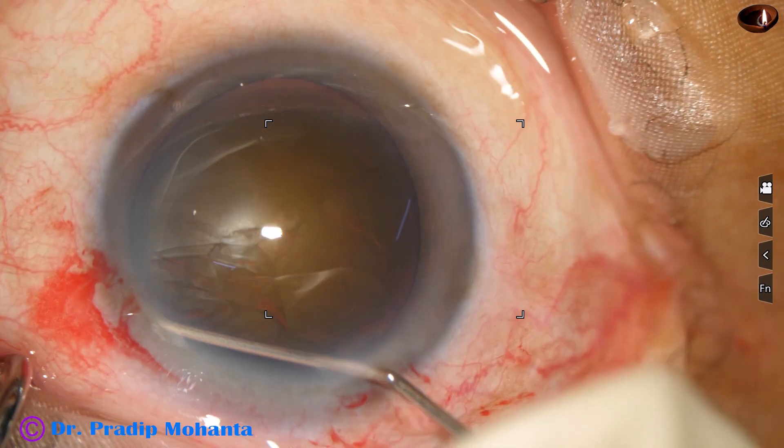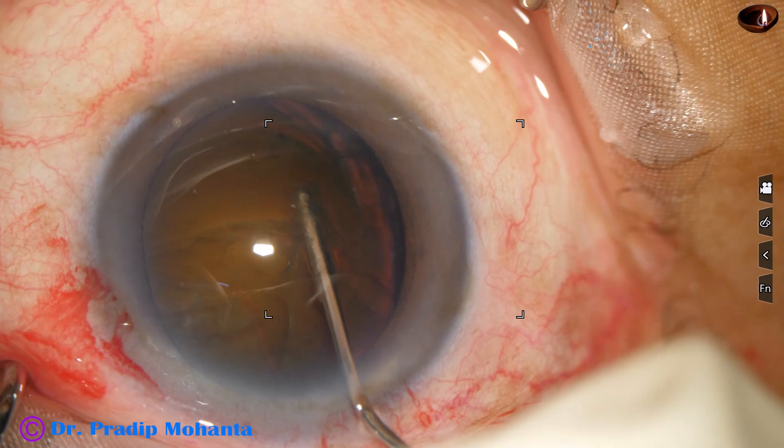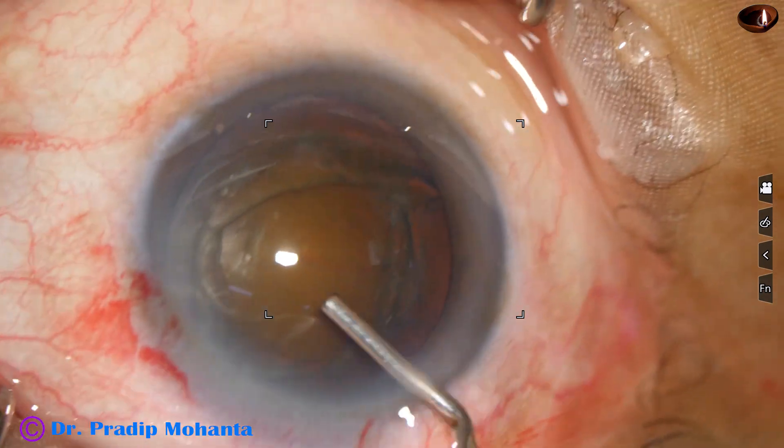And now hydro-dissection is done. You can see the fluid wave going from one equator to the opposite equator. And now viscoelastic again.